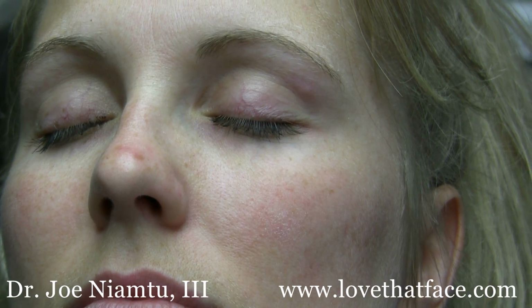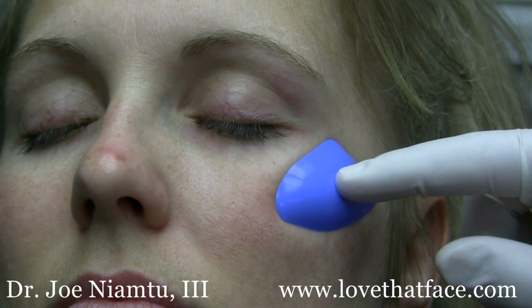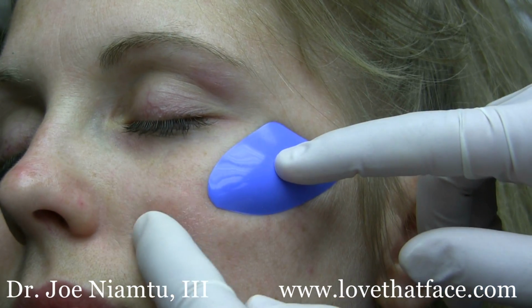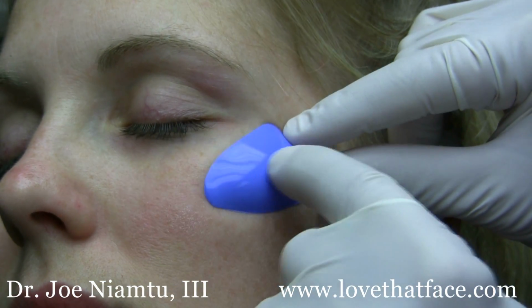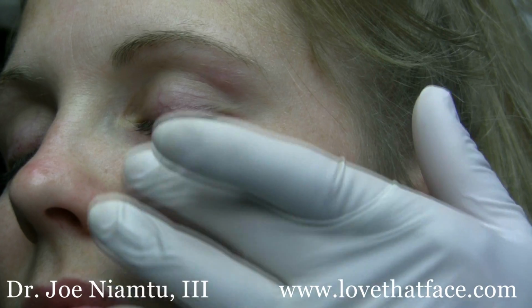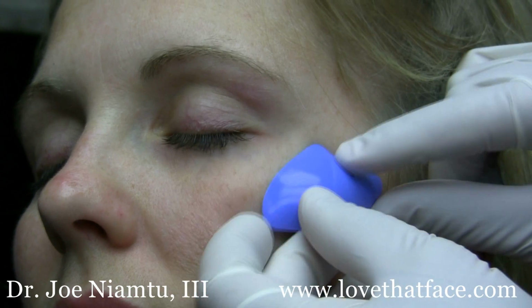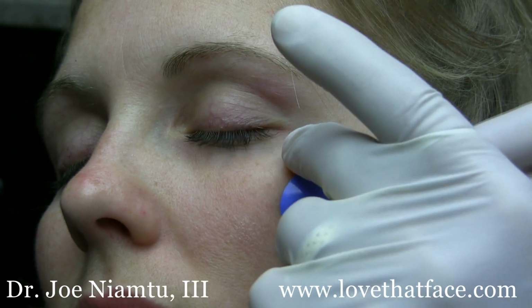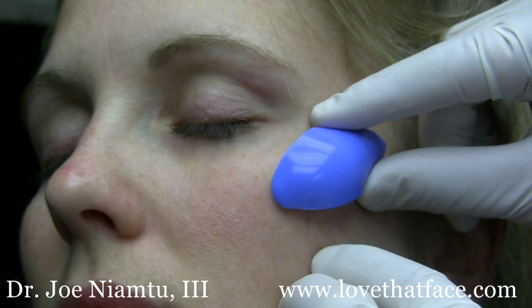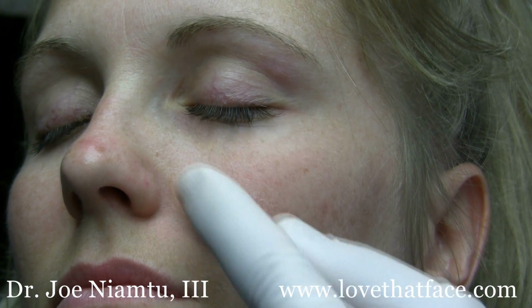Another kind of implant, and I hardly ever use this, is a malar shell implant. Now this implant is for people that want just the high cheekbone look, and it doesn't do anything over here, and it does very little over here, so the prominence of that implant is right there. And every once in a while we'll have somebody who has adequate tissue here, but they're really deficient here. And that's what this shell implant is for. And personally, I think when implants became popular 30, 40 years ago, people more often were looking for this big cheekbone, and I think it's a little bit out of style. I think contemporary patients want this nice, soft improvement here that this patient has.